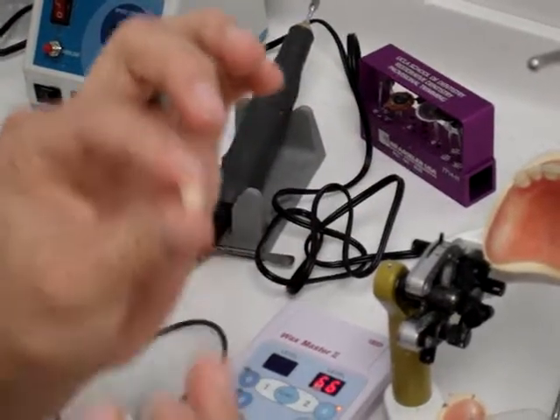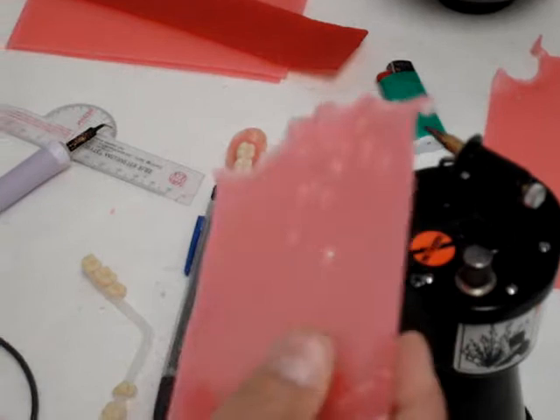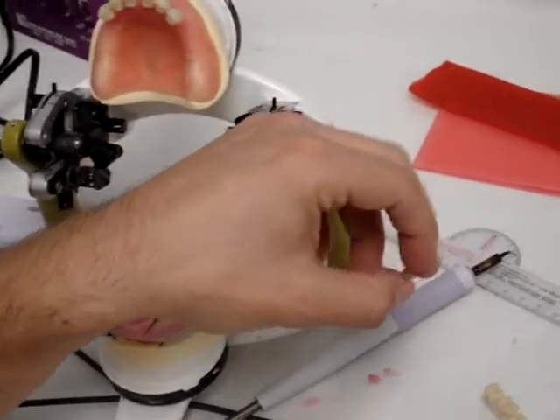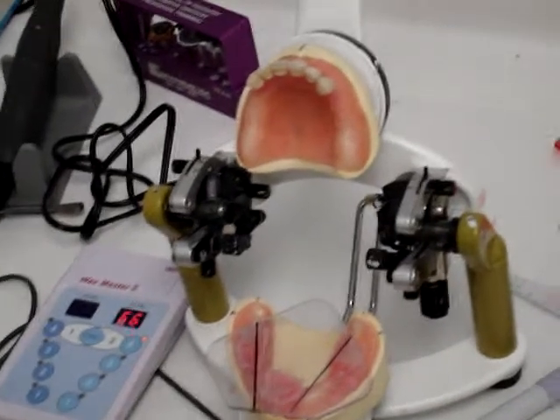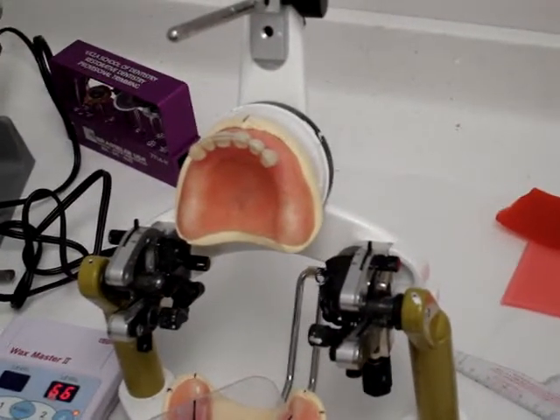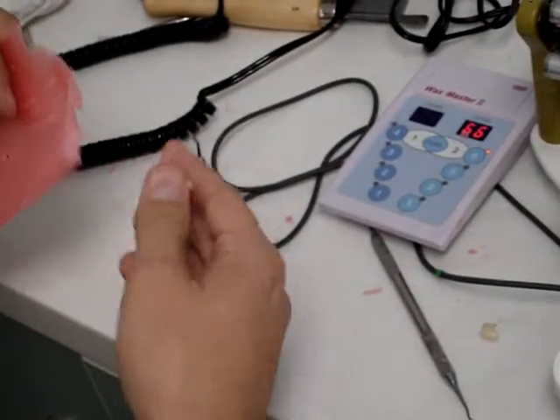So one dot on the mesial. Now we're going to set the premolars. I always set two teeth at a time — I always set the contralateral tooth when I'm setting, meaning if I'm setting a first premolar, I'm going to set the contralateral premolar on the opposite side. For our purposes right now, to save time, I'm only going to do one side.